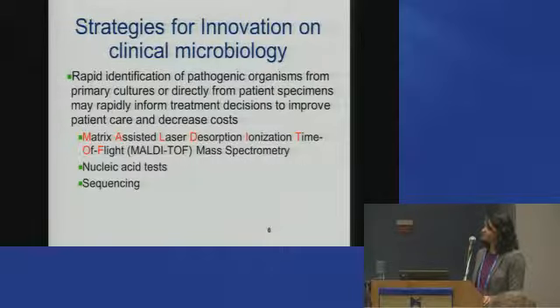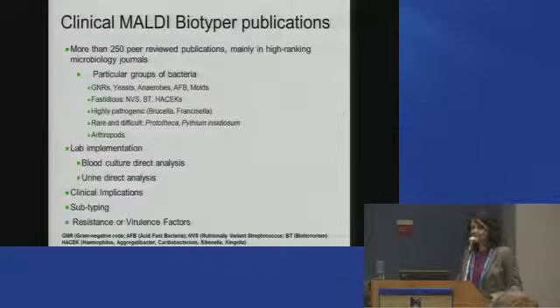And to do that, we've actually been utilizing three different technologies. One is the MALDI-TOF, which I'm going to talk about in detail today. We've also implemented a number of nucleic acid-based tests, and then, of course, sequencing, which we have in place as well.